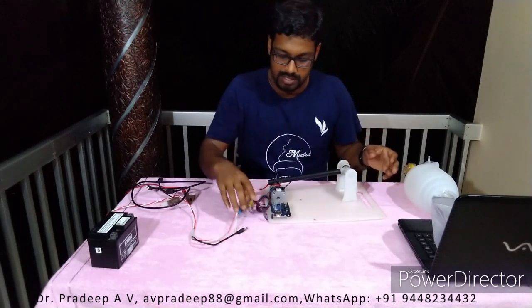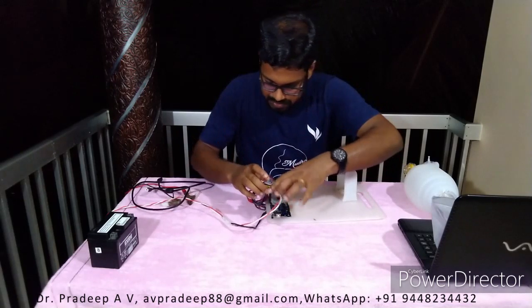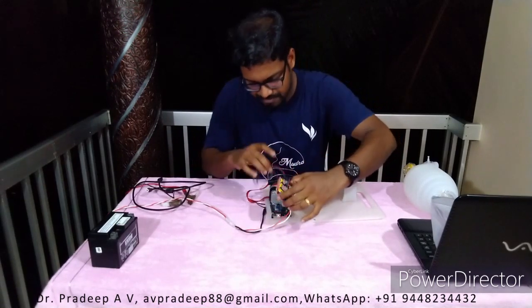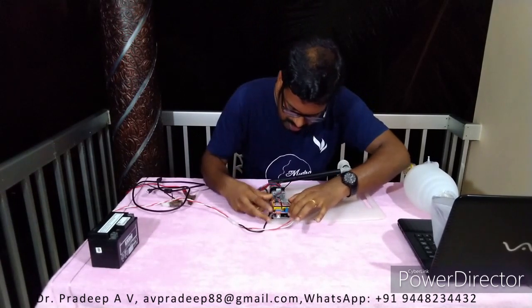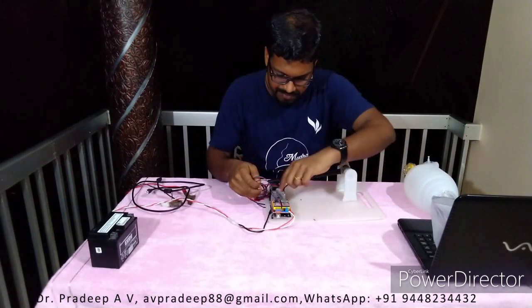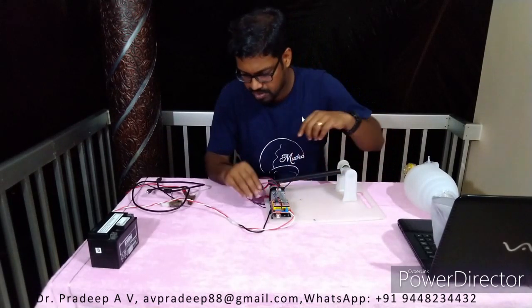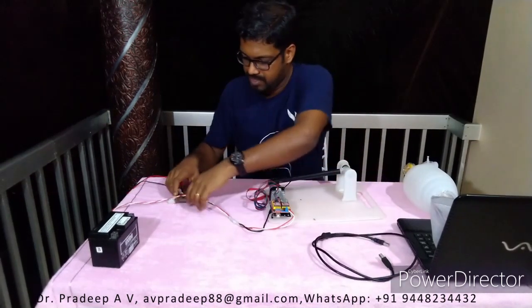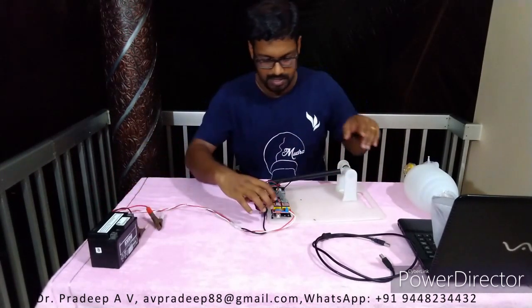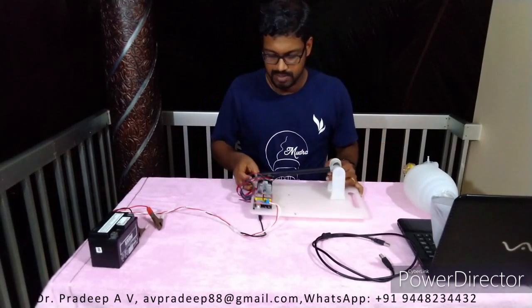Let's look into it. So I'm going to mount this CNC shield to the Arduino. I have already made the wiring. I've mounted the CNC shield, and from one stepper motor control, I have made the connection to the stepper motor. This is here, and this I want to interface with the PC, and this one I want to power. Okay. So now the design goes like this.